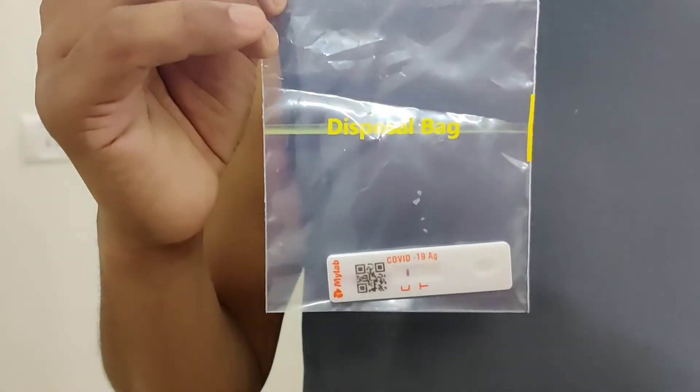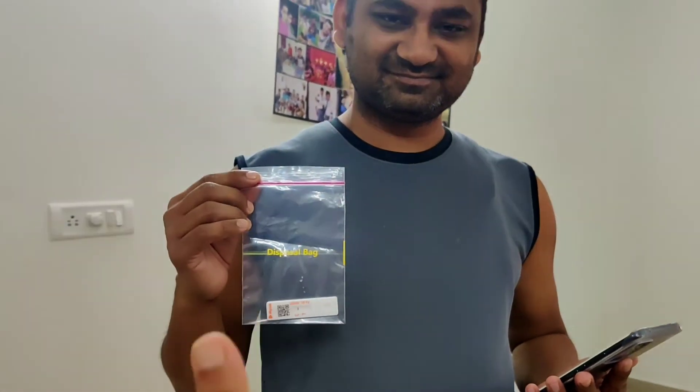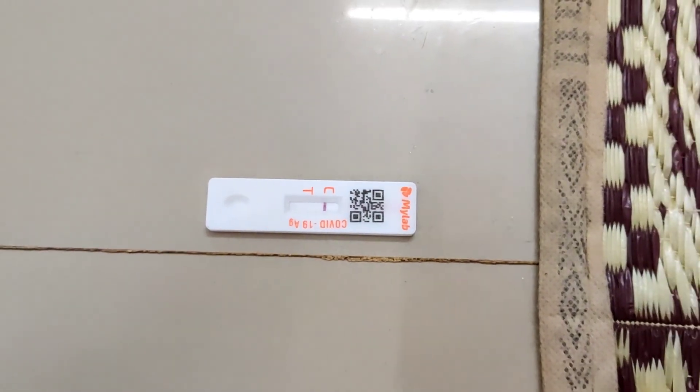We are lucky that we are negative. But if you have symptoms after this test, you must do the RT-PCR test.